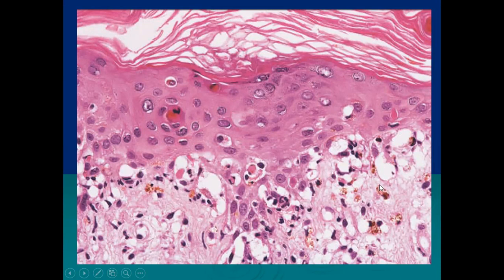In addition, the pigment, which should be present in the melanocytes, has fallen into the upper or papillary dermis. You also notice these pink cells in the epidermis, and these are the necrotic cells, also known as single cell necrosis. The necrotic cells are also seen at the basal layer, and these necrotic globules at the basal layer are known as colloid bodies or civatte bodies.